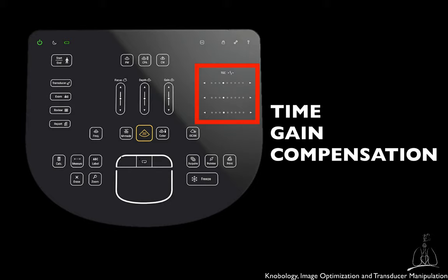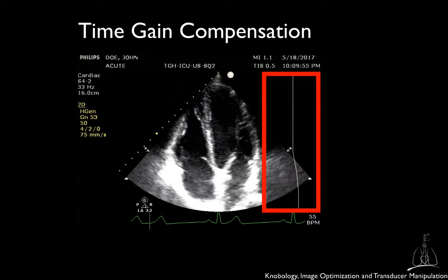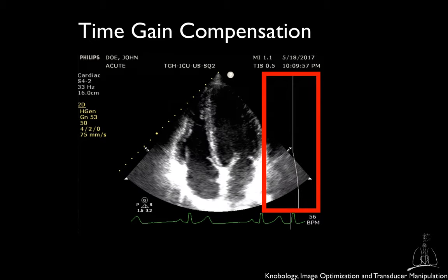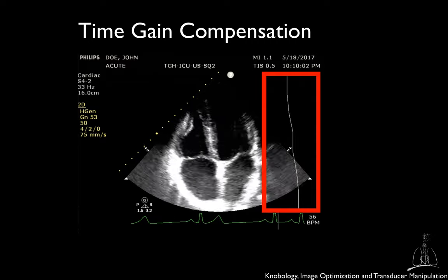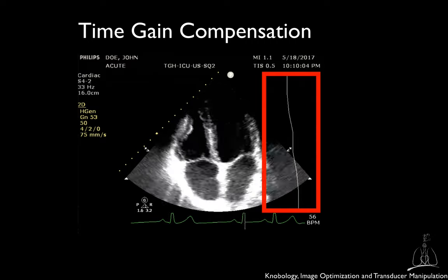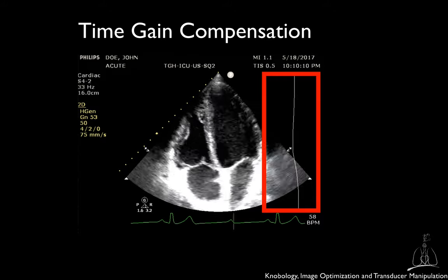Another function that can be adjusted to improve the quality of the images is called compensation. Ultrasound waves are attenuated as they travel through the tissues. Therefore, identical structures located at different depths would appear of different brightness due to the attenuation process. Deeper structures will appear darker than the superficial ones. With compensation, also called time gain compensation or depth gain compensation, you can create an image that is uniformly bright from top to bottom by adjusting the amplification or gain selectively at different depths.